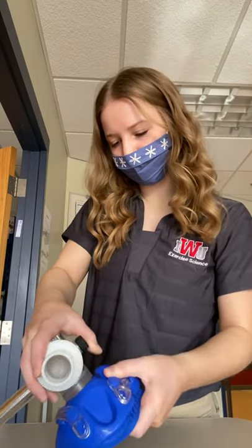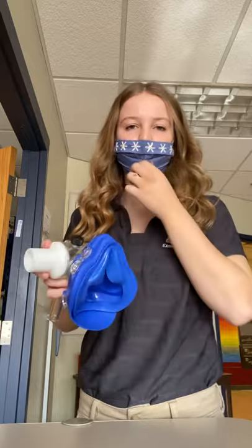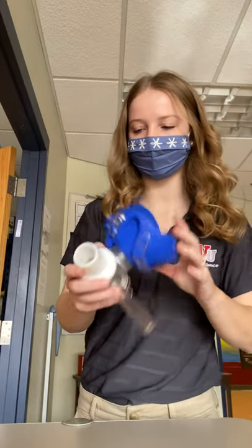You just kind of have to pull and work it in. Then you'll look at the other side of the mask just to make sure that it's threaded correctly — it should just look like that, just a plain circle on the inside.